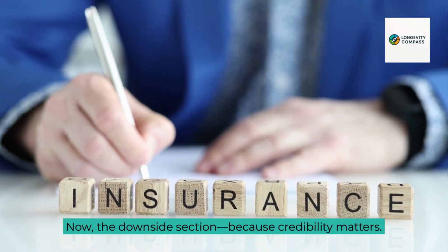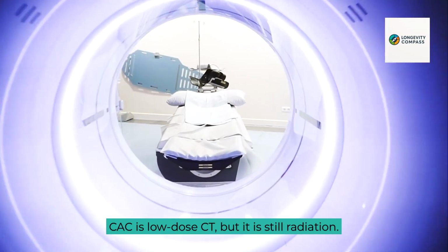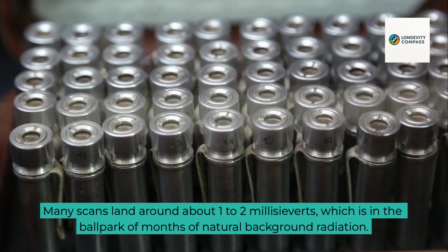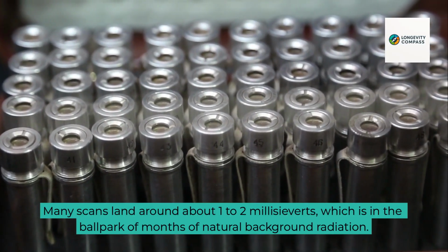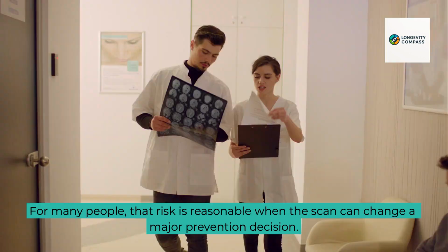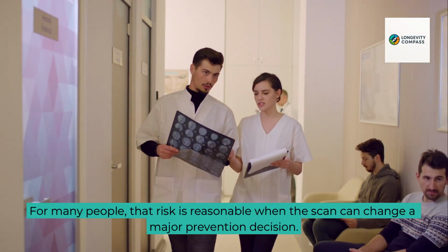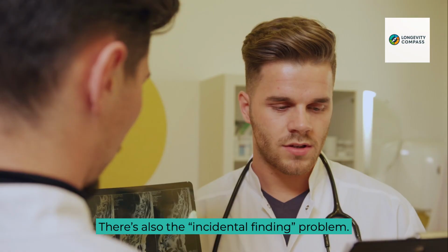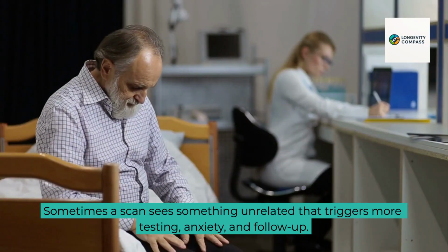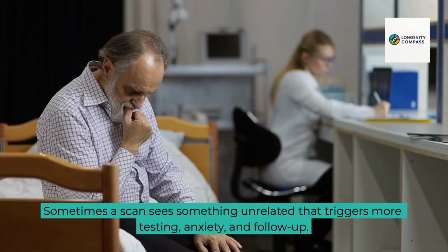Now, the downside section, because credibility matters. CAC is low-dose CT, but it is still radiation. Many scans land around about 1 to 2 millisieverts, which is in the ballpark of months of natural background radiation. For many people, that risk is reasonable when the scan can change a major prevention decision. There's also the incidental finding problem. Sometimes a scan sees something unrelated that triggers more testing, anxiety, and follow-up.